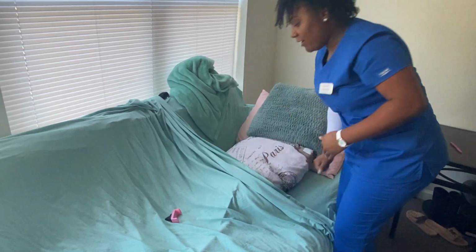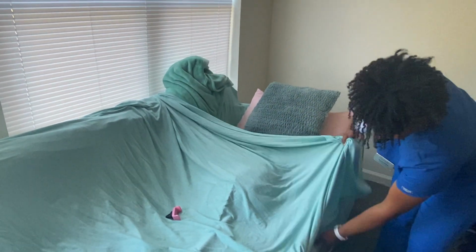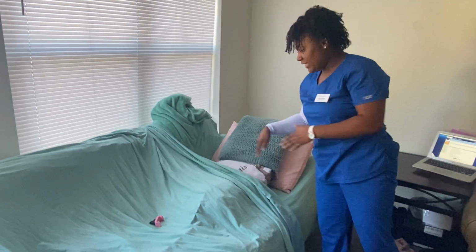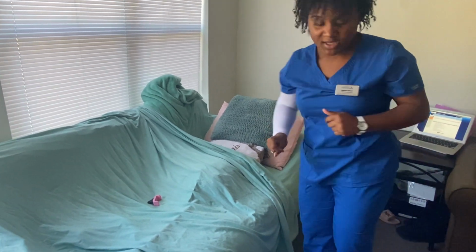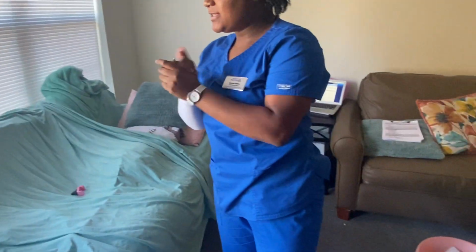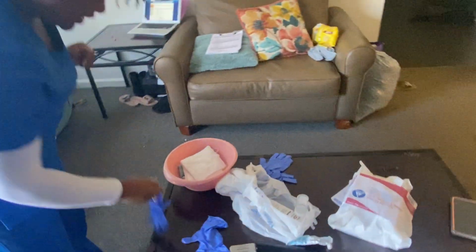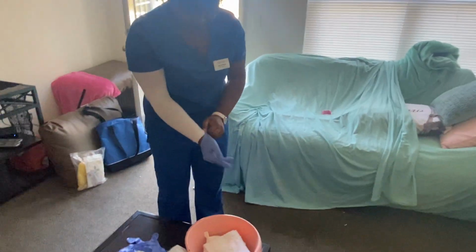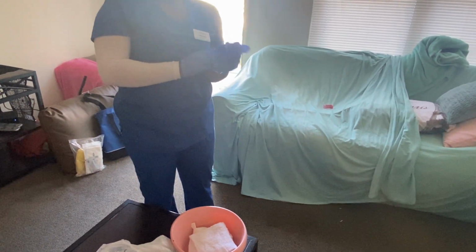Okay, so now I'm about to get started. We see that you have a lot of urine backed up in you. So first, let me clean around your perineal area. Okay, so first let me wash my hands. And I'm gonna gather my gloves, 3 towels, and a water basin.